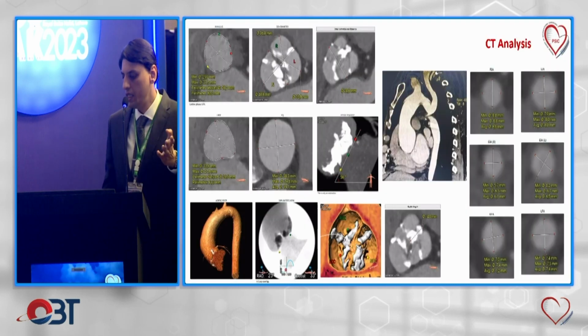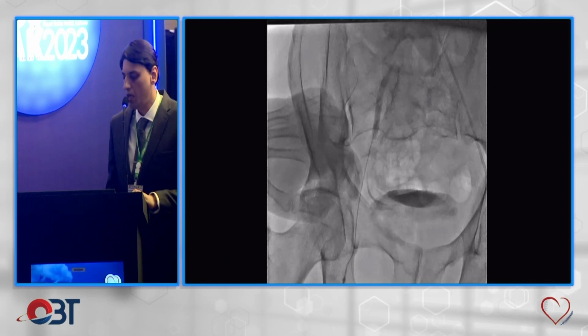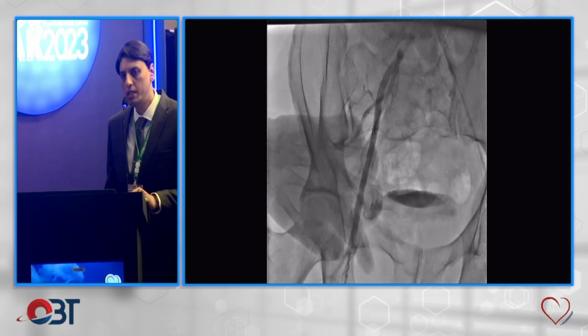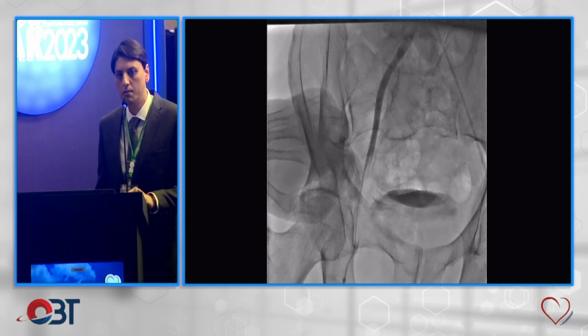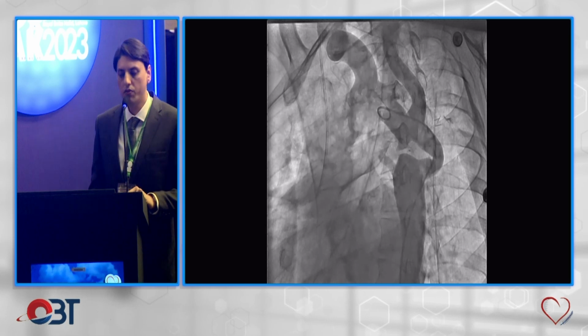So as you can already see, 26, we decided for the valve of 34, and we decided for a pre-dilatation of this heavily calcified valve with a 25 balloon. So usual technique that we use, ultrasound-guided micropuncture access. We took the angiogram of the coarct.